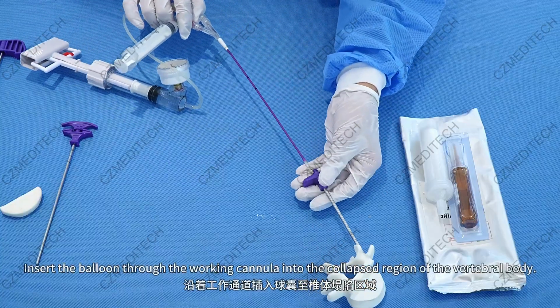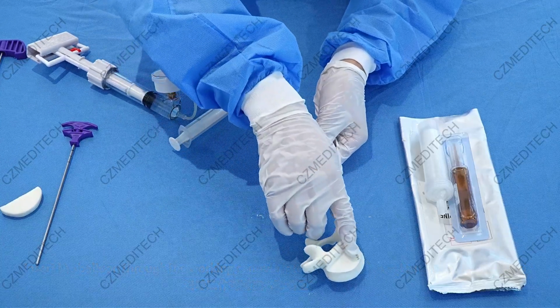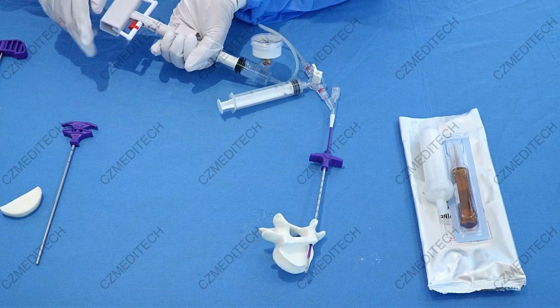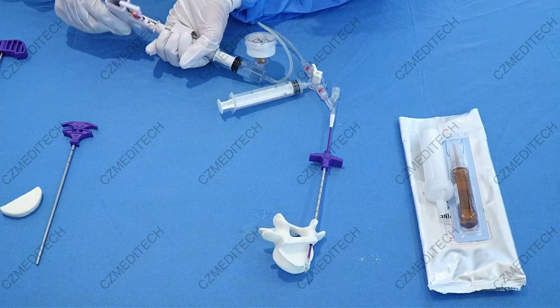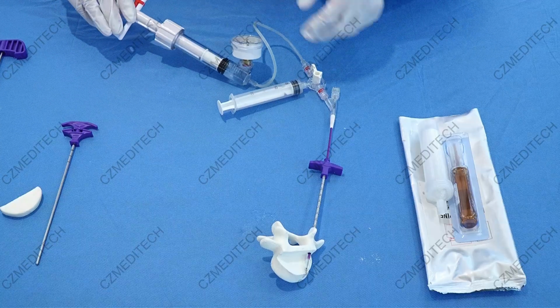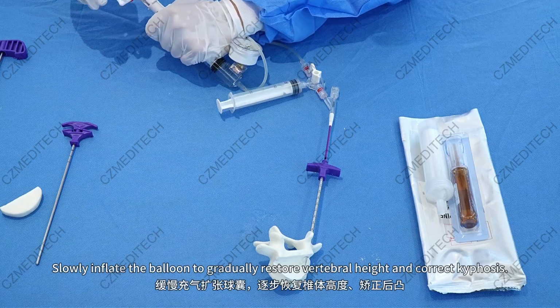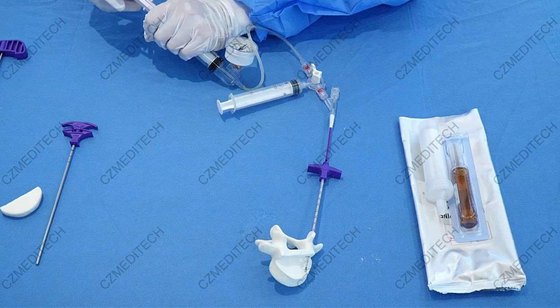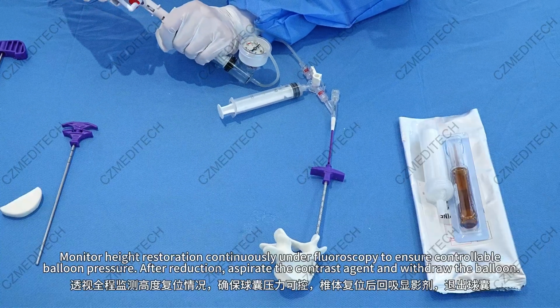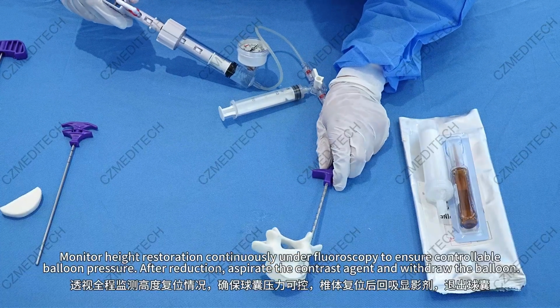Insert the balloon through the working cannula into the collapsed region of the vertebral body. Slowly inflate the balloon to gradually restore vertebral height and correct kyphosis. Monitor height restoration continuously under fluoroscopy to ensure controllable balloon pressure. After reduction, aspirate the contrast agent and withdraw the balloon.